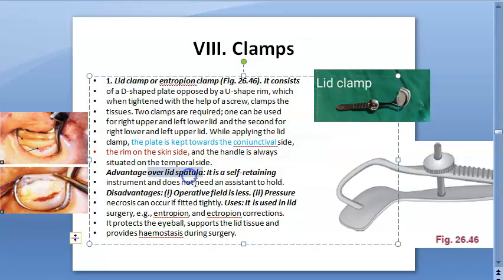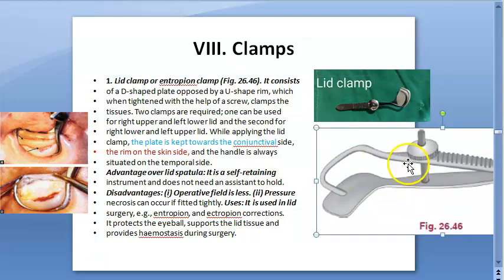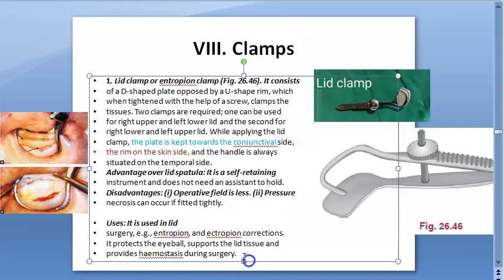Comparing it with a lid spatula — the advantage of this lid clamp is that it is self-retaining; it has a screw, so you don't need anybody to hold it. The disadvantages are that the operative field is less, and pressure necrosis can occur if you fit it too tightly. It is used in all lid surgeries — entropion, ectropion correction, etc. Its job is to protect the eyeball, support the lid tissue, and provide hemostasis during surgery.